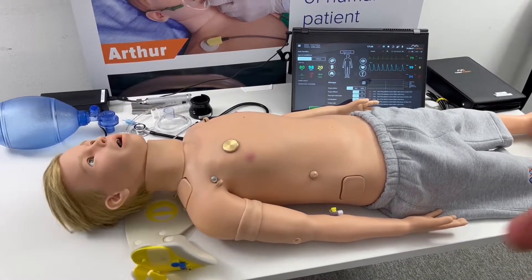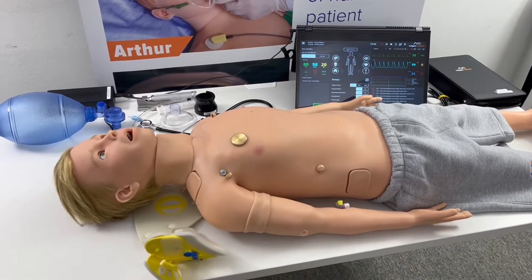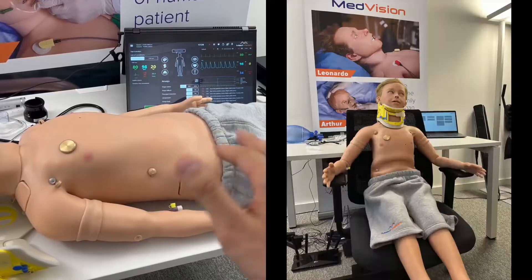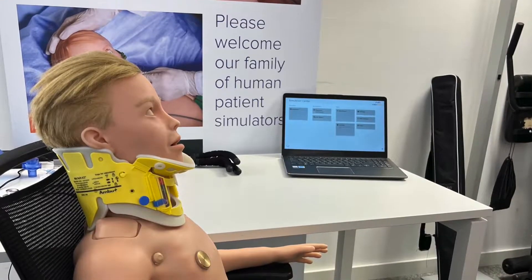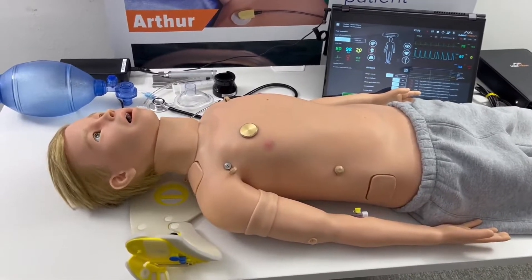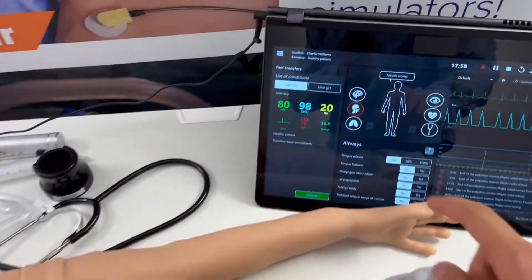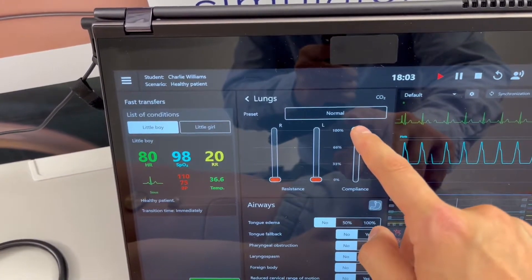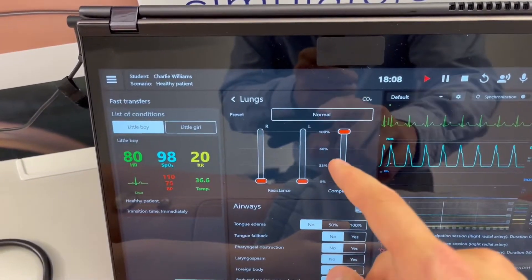Other improvements include Arthur sitting up more easily for scenarios that require that — the joint in his hips has been made a little more pliable so that he sits up more naturally. Additional improvements include urination with actual liquid output, and improved compliance settings so that when you are ventilating him with a real ventilator you get a more realistic experience. In the lung icon you can see the compliance slider.